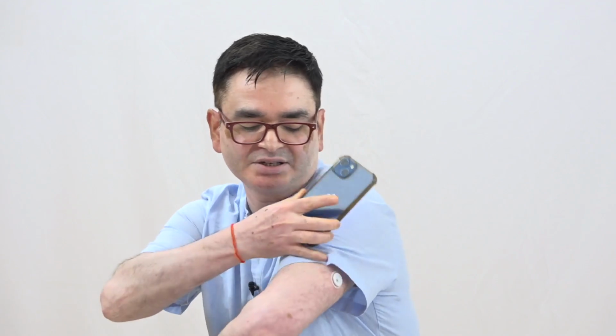Right? Good. Ease of use, right? That's why I call it a digital twin. So now we need our subdermal wearable devices to have the same kind of easy format. You see, I did a demo and showed you how you can use these sensors. Okay, and then this can be disposed of, and the next thing you do is bring your phone, and it says apply a sensor. It gives you all the directions, all the instructions that you need through the app. You say next, and then you scan your sensor.